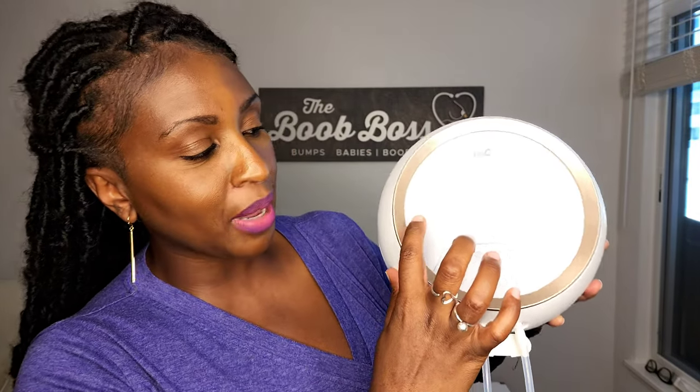So I don't even have to close this port, because remember, it's got two separate motors. They work completely independent of each other. So let's put that back there. And then if I turn on the right, you can see here that when I last pumped, I had a vacuum of 3 on the left and a vacuum of 4 on the right. My cycle was up to 5.